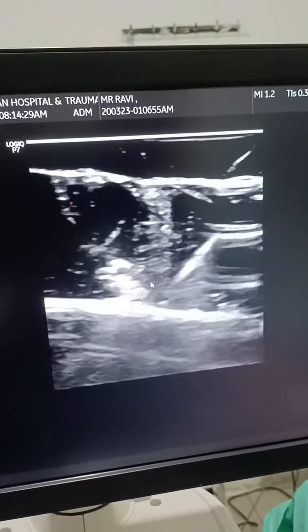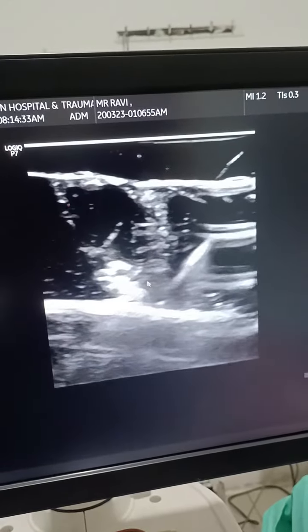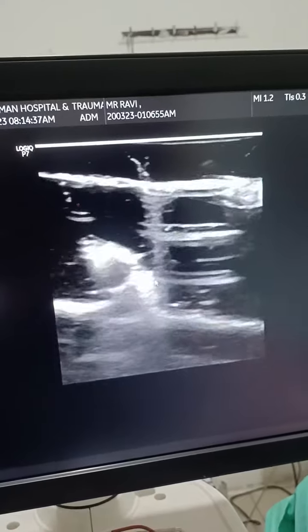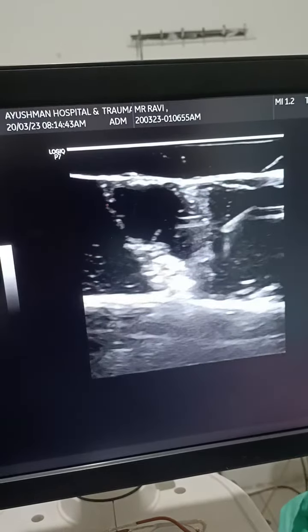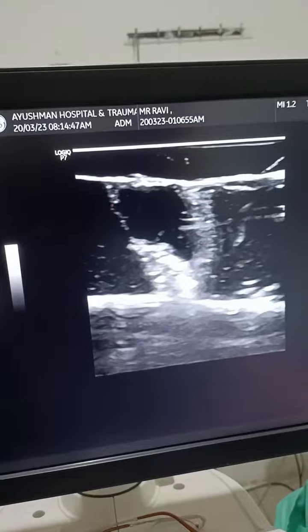And now I am touching the first rib, and we will deposit the local anesthetic here also. This is our subclavian artery, and this was our brachial plexus. So this is your trainer for practicing brachial plexus block. Thank you.